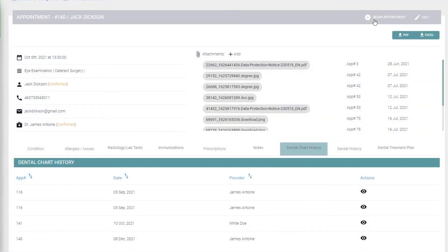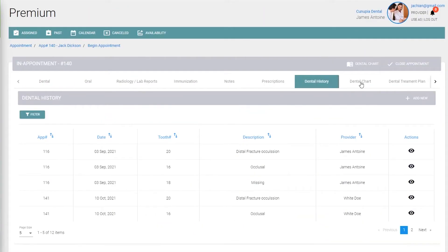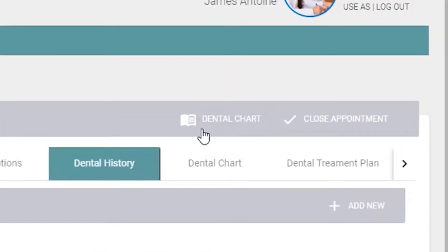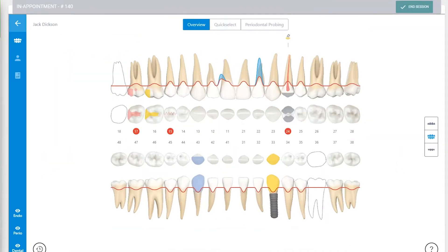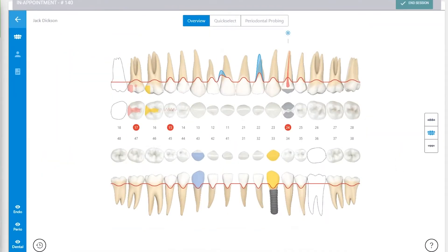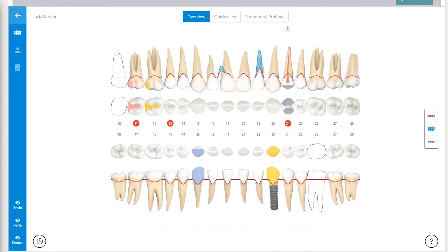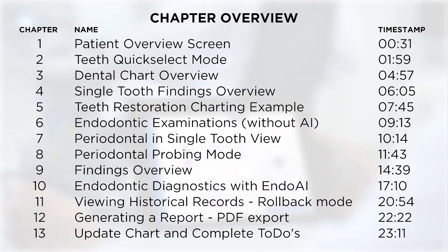For dental practices, Zuma has partnered with Derek to enable first-class cloud-based dental charting that can assist you with your daily workflow. Here are the aspects that we will go over in this Dental Charting Walkthrough.